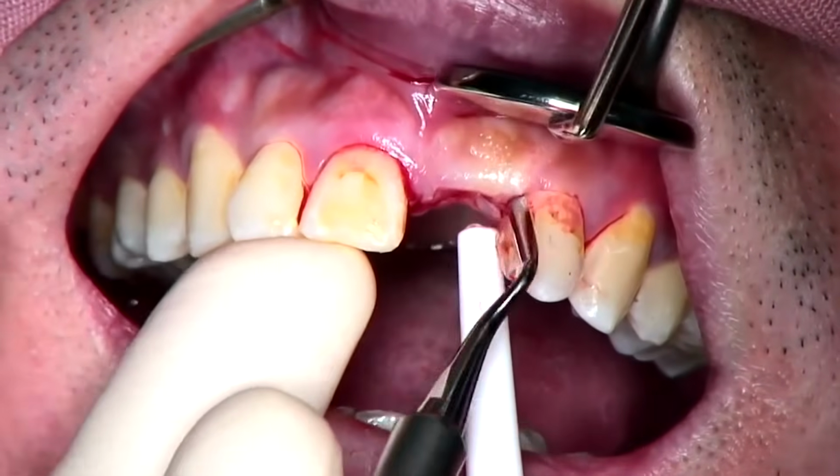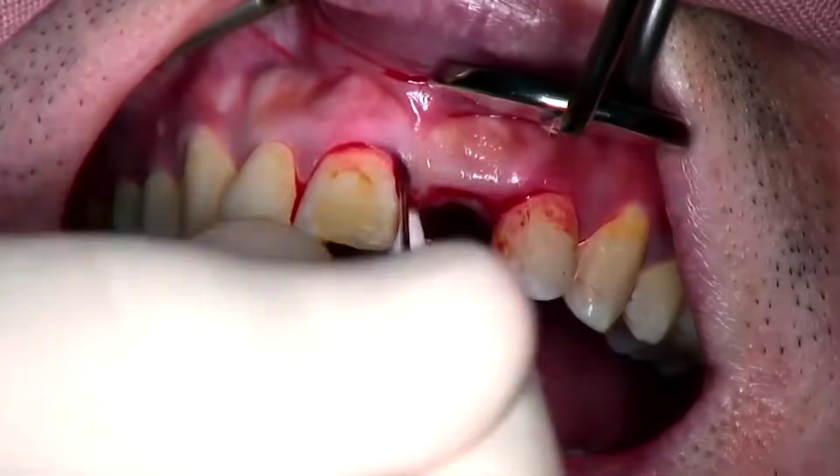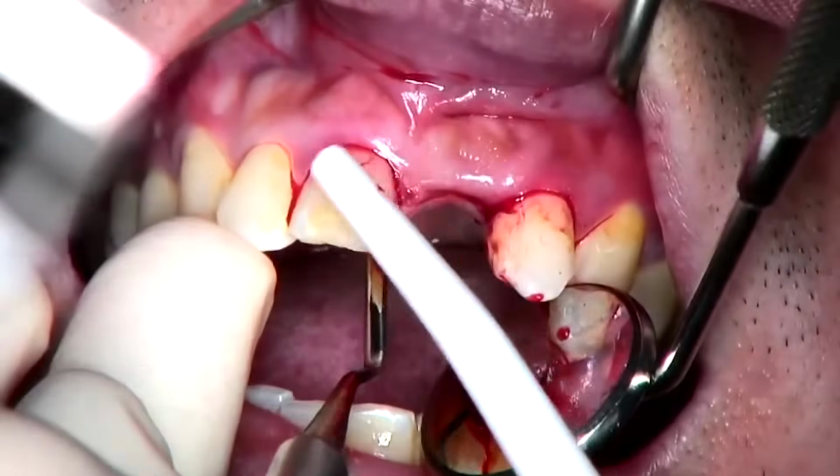The periotome is a non-cutting instrument and can gently and effectively detach the gingival tissue from around the teeth and allow first contact with the underlying bone.